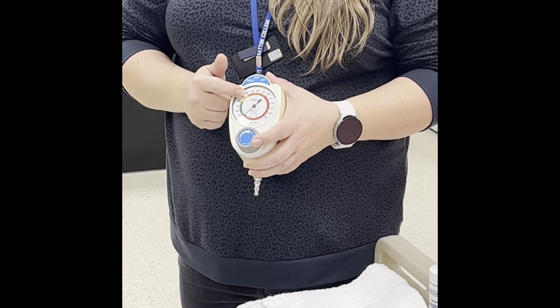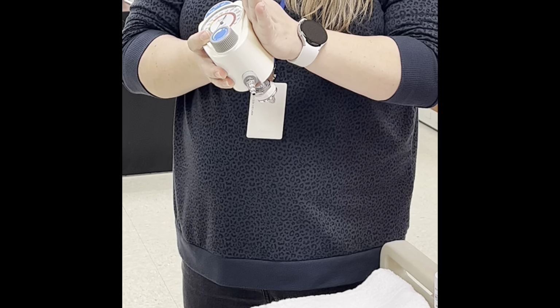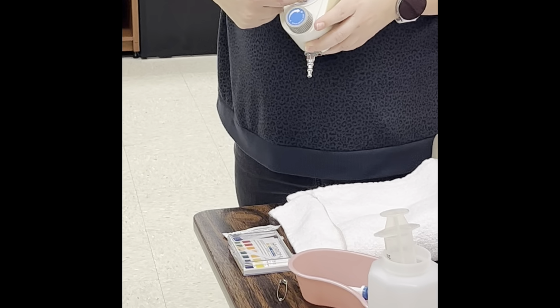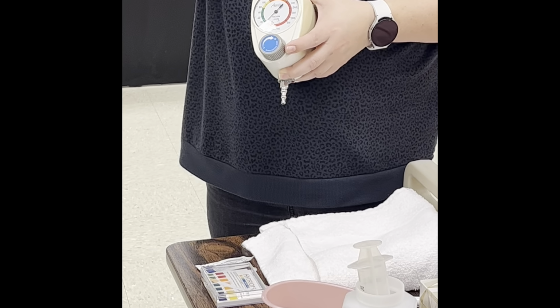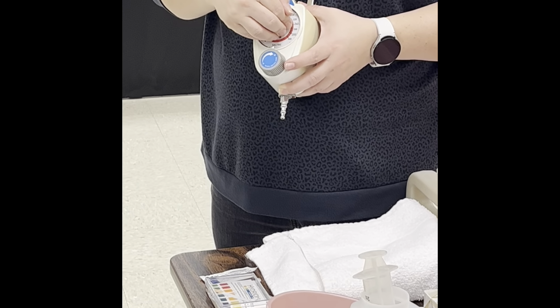Yellow, there's a little bit more pressure, and red is if you took your hand to your vacuum and you could feel it sucking your skin. That's what that's doing. It is sucking. Do you want something in your intestines sucking at that? No, because guess what's gonna happen? It sits there and sucks. It will eventually perforate wherever it is, usually your stomach.